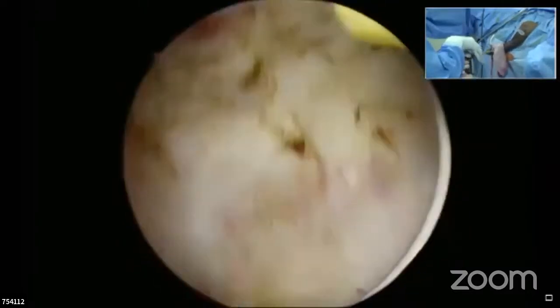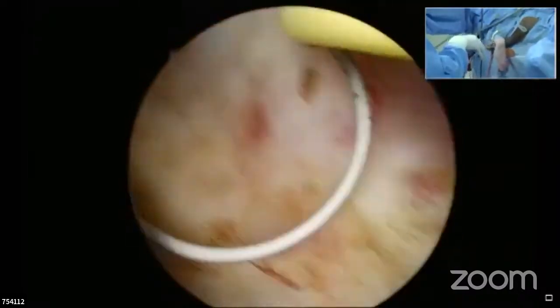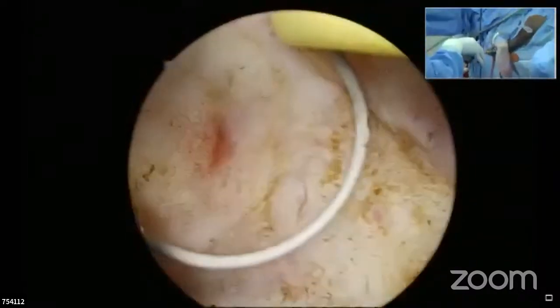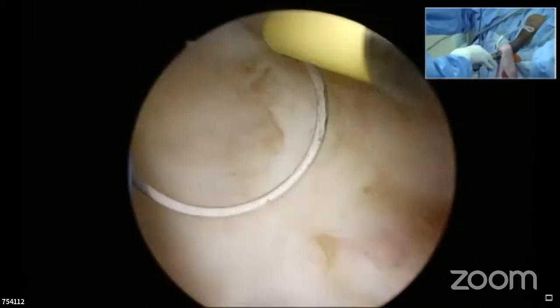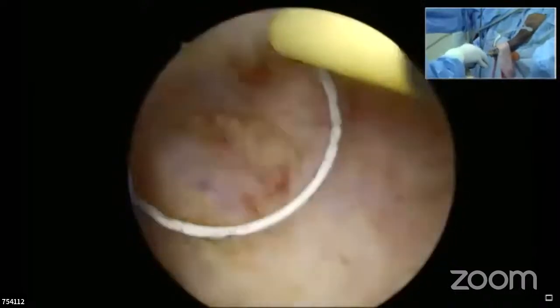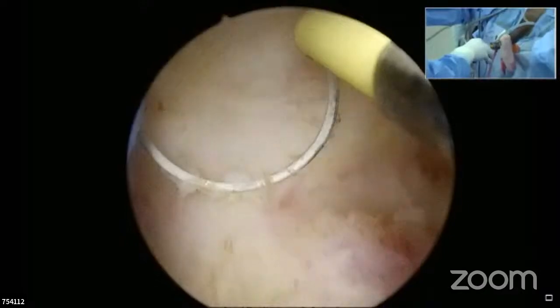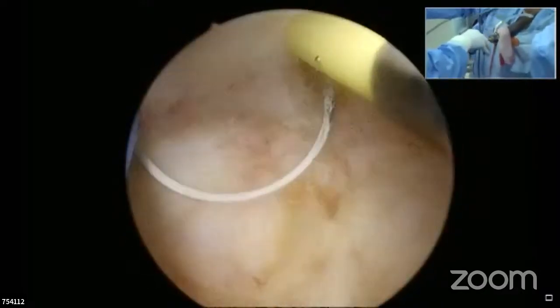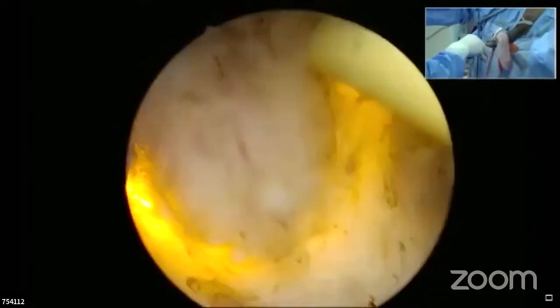So Dr. Raghuveer wants to know, if this is PI-RADS 3 or 4, I would like to do a biopsy before doing a TUR prostate. No, the gland size was more than 150 grams, so I thought it is a volume-related increase in the PSA. Yeah, that's the reason why we did an MRI. If the MRI is normal, that's the reason why we go ahead with the resection.